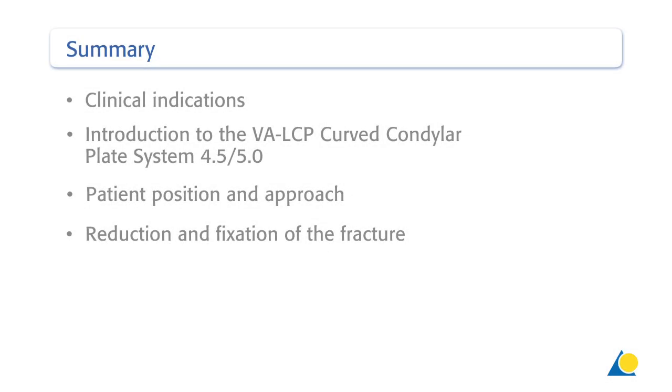This presentation has shown the clinical indications, an introduction to the principles of the variable angle LCP curved condylar plate system 4.5/5.0, the patient position and approach, and the reduction and fixation of the fracture.